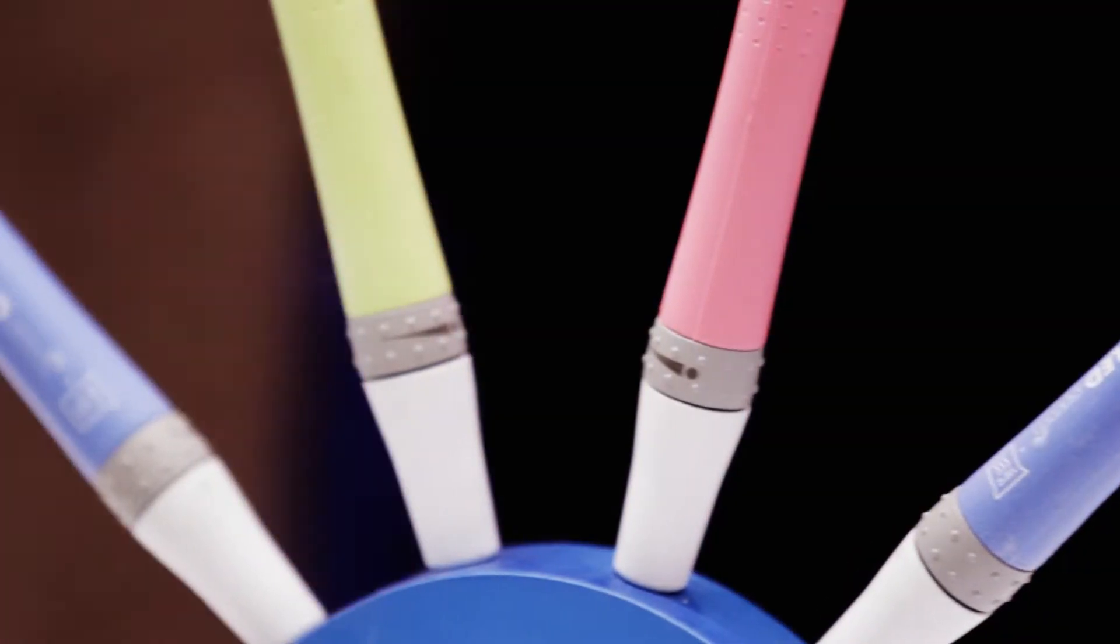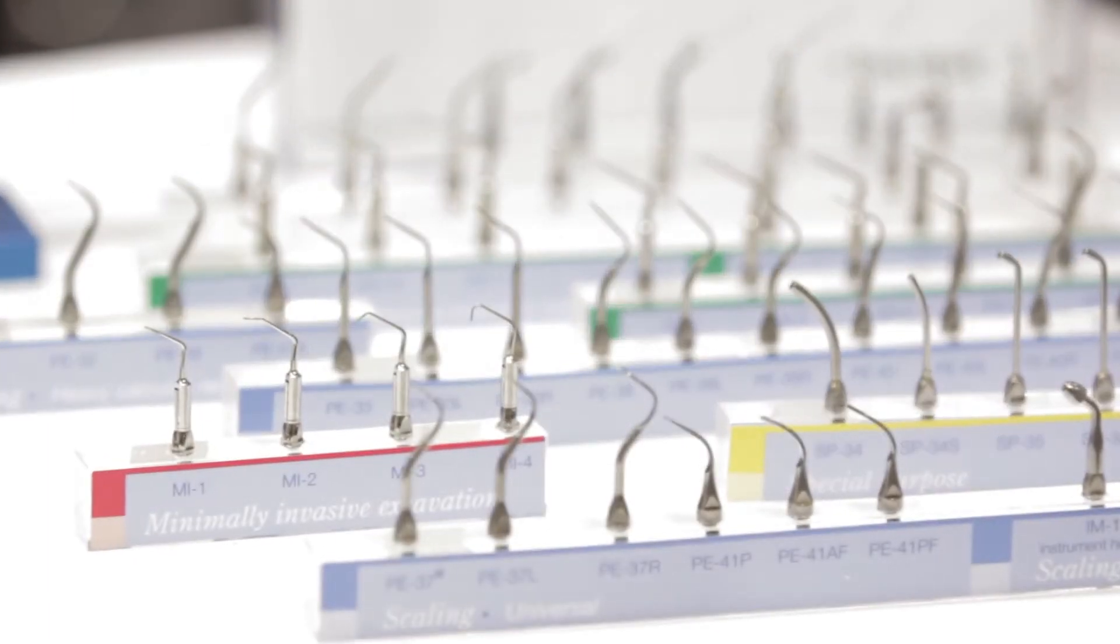The sleeves come off and you put those in the autoclave, and you can swap out the tips if you need to. There are over 60 different tips on the scaler side.